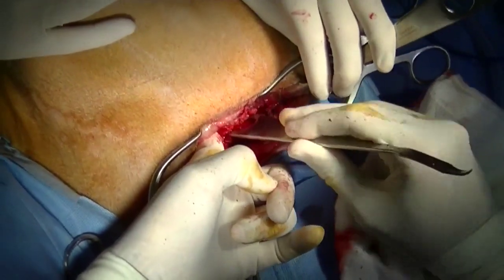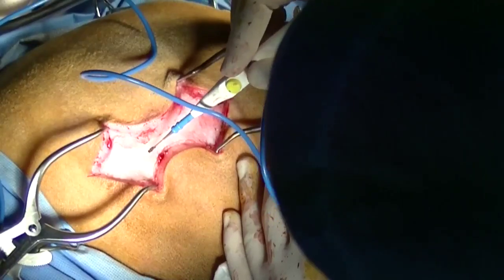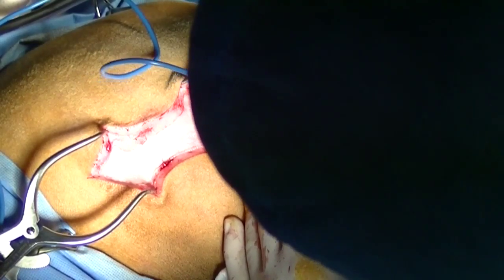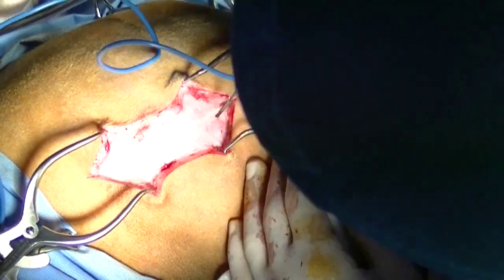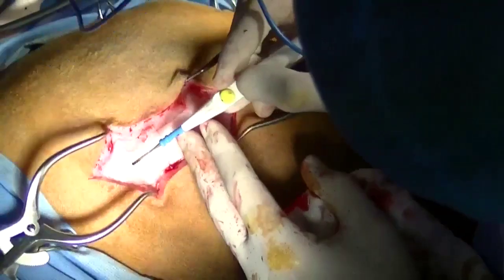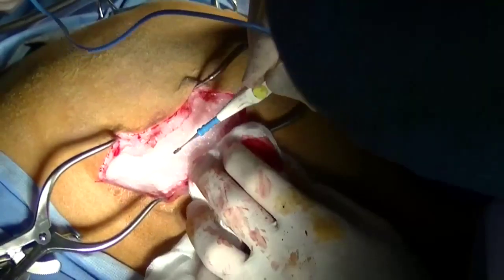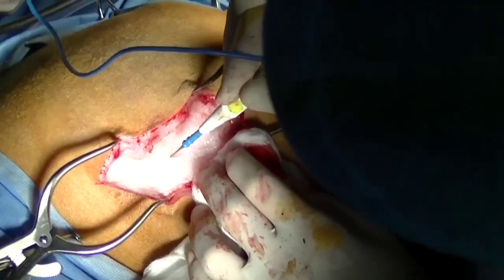This part of the incision is closed routinely and then a lateral approach is made to the ileal shaft. I prefer to do a muscle splitting technique rather than sharp dissection through the muscle bellies because I believe this results in a less painful recovery and more rapid return to function.